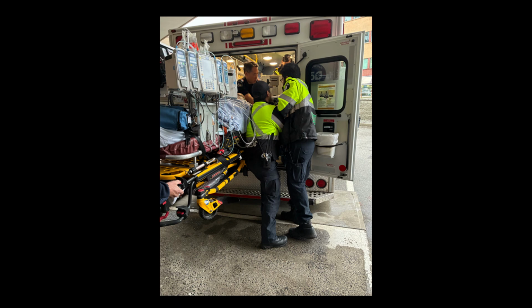On arrival to the receiving site, the patient will be unloaded in unison with the intra-aortic balloon pump coming out of the ambulance. The team will then transport the patient to the receiving unit and provide handover on the aspects of patient care they were responsible for. Questions, reach out to your CNE.